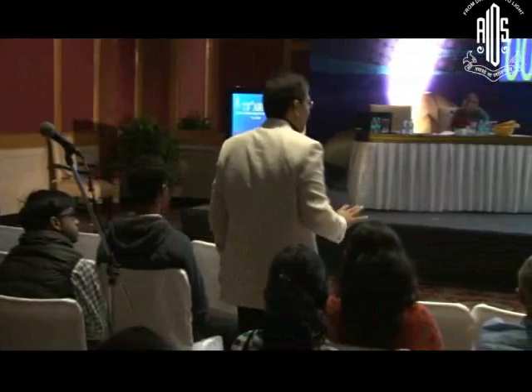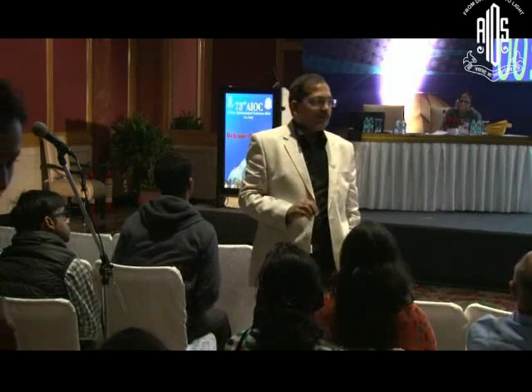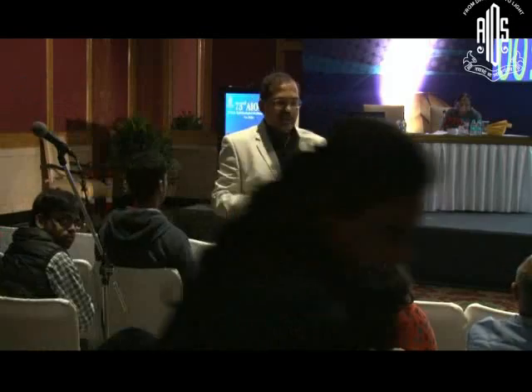Imagine the same guy comes with minus 8. Same guy, 500 microns, minus 8. Now I have only 70 microns. I can only correct 4.5 diopters. 3.5 will be residual. Now what will you do? There are two options here.